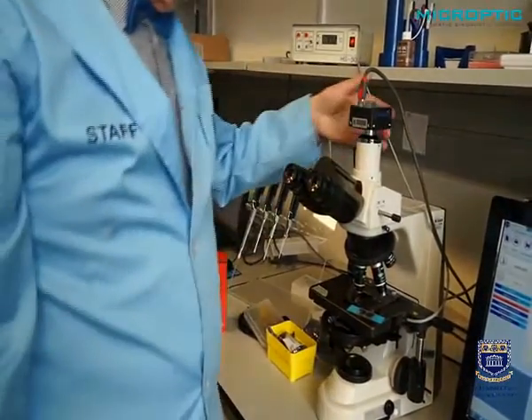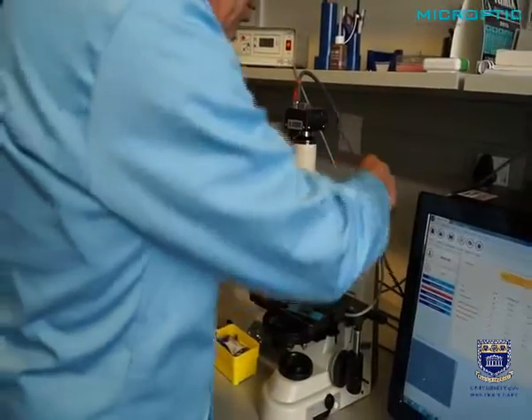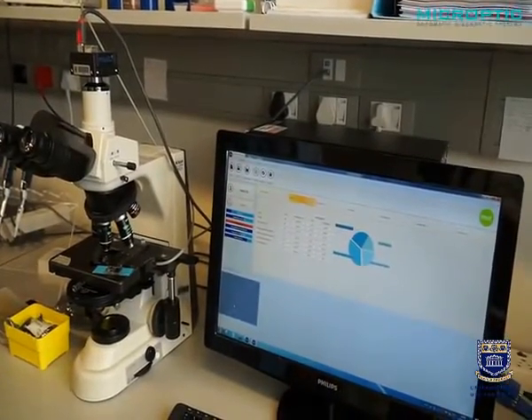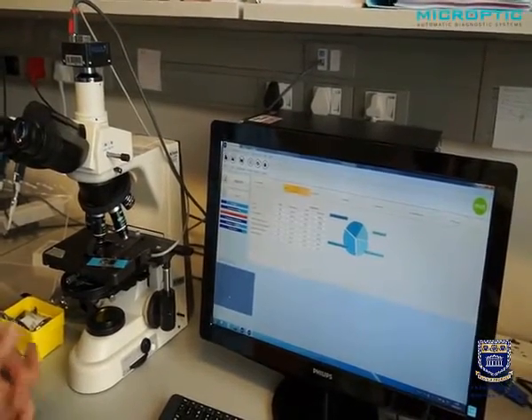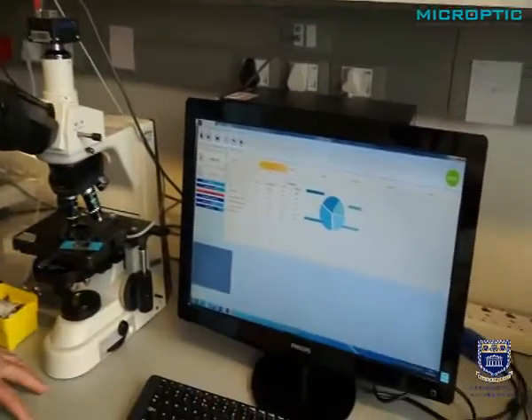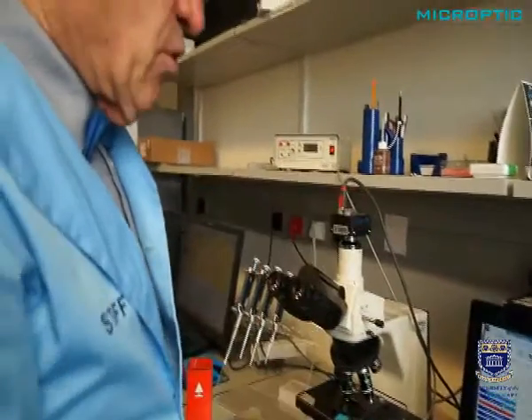The next step is that this signal, for example the motile sperm, is now fed into your computer. And again, one must take a great deal of care. You cannot just use a computer with any settings. It's preferable to use a Hewlett-Packard computer with lots of RAM and very fast processors, and make sure that if you work with Gigabit Ethernet, it has the proper Gigabit Ethernet card at the back. So those are the absolutely important requirements for being able to start your work at all.